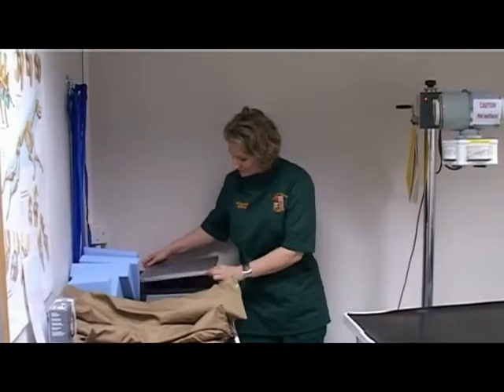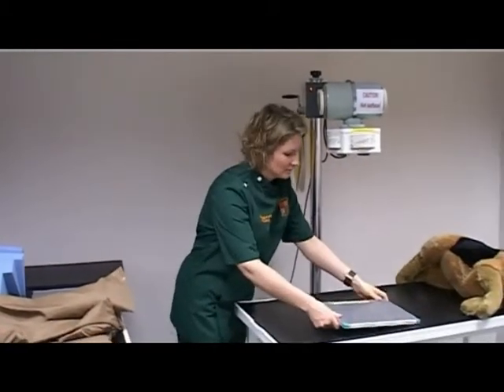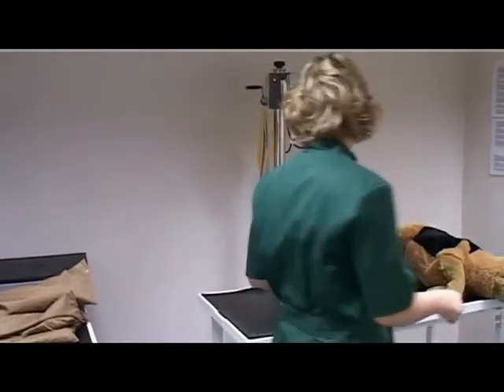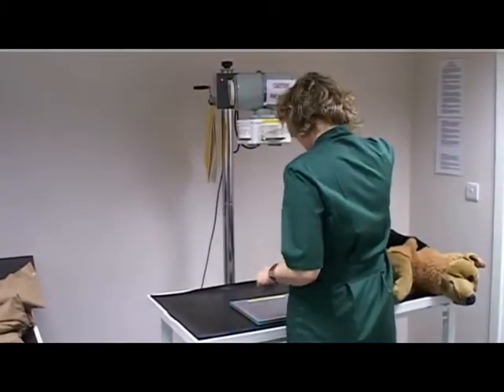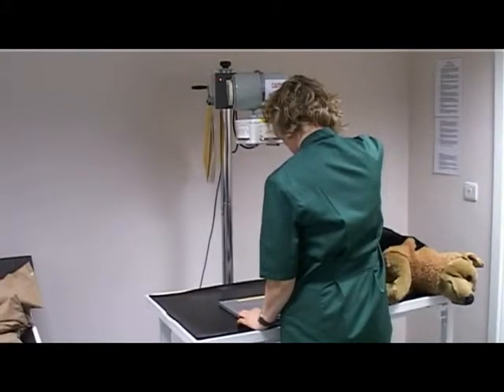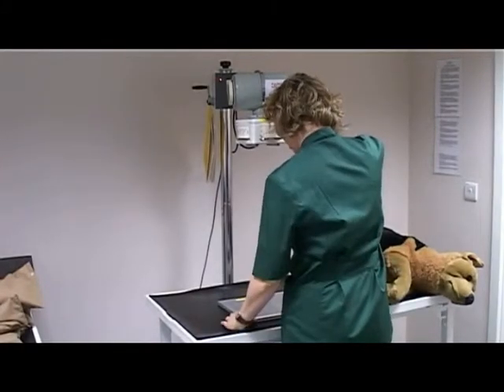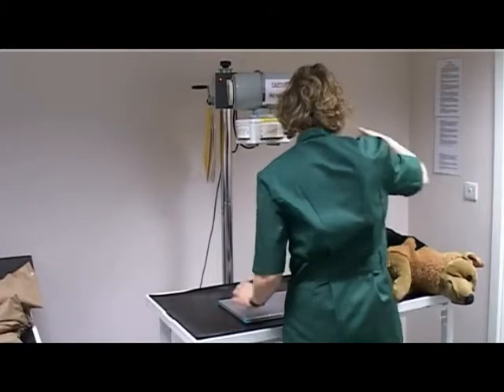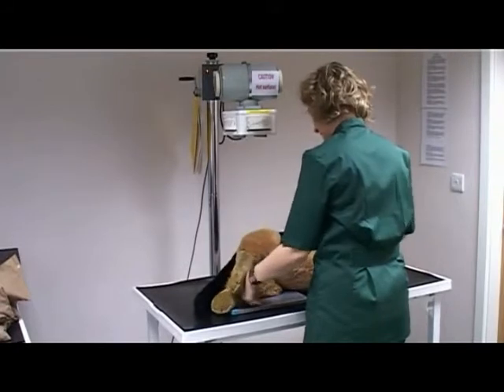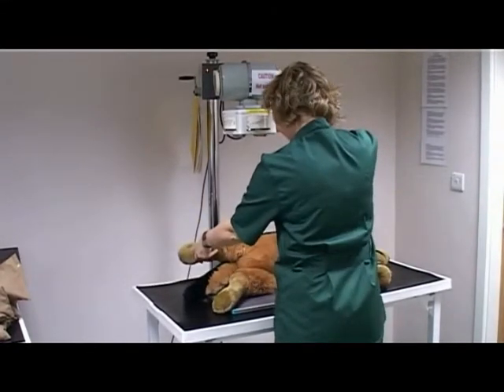Select a medium sized cassette and place it the correct way up on the table. Collimate to within the edges of the cassette. Place the patient in left lateral recumbency with the tibia and fibula region positioned on the cassette.